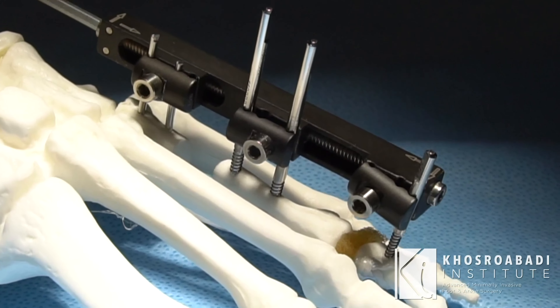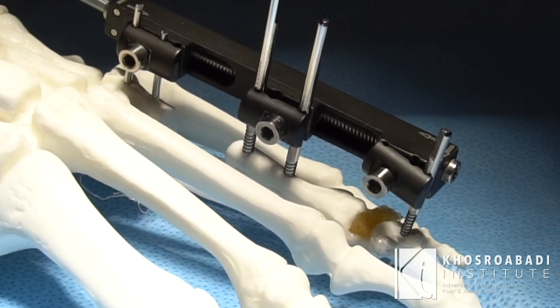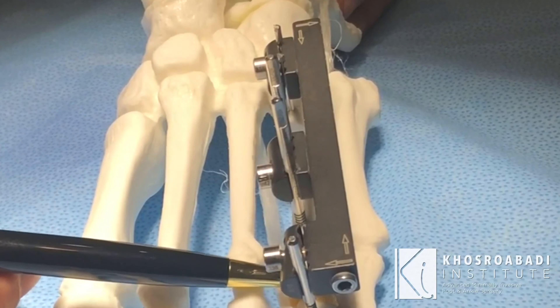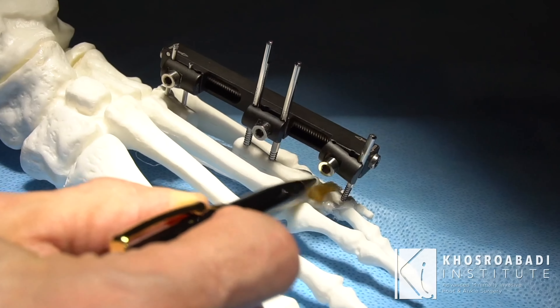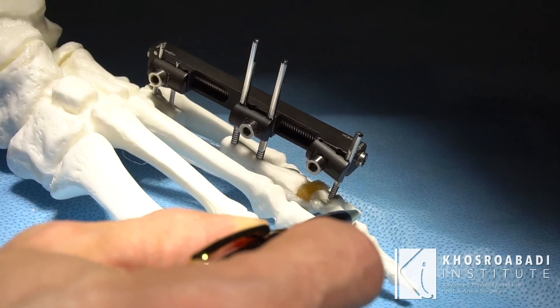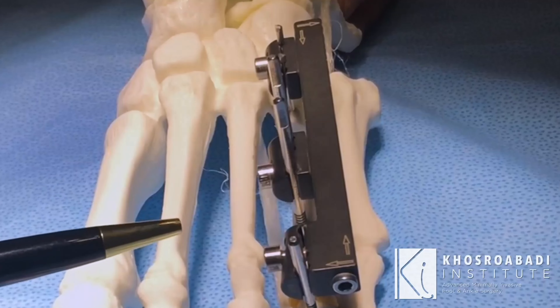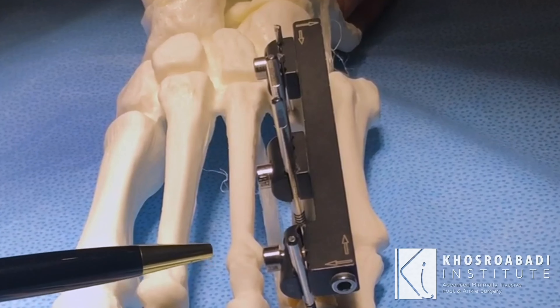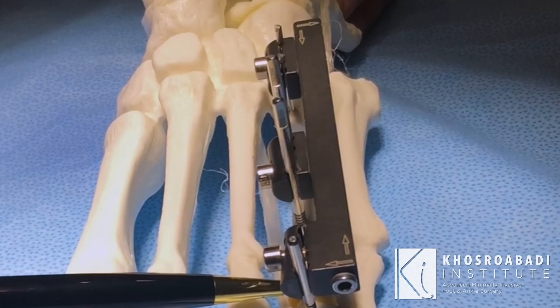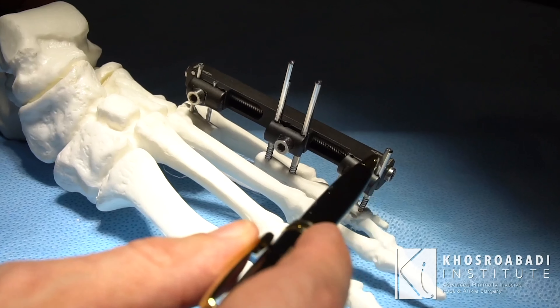As I'm lengthening the bone, you can see the metatarsal starts moving with the segment of the bone. We can even measure this — the distance between that bone and this bone stayed the same because the segment of the bone was taking the toe with it and maintaining the joint space. This construct helps prevent one of the most common complications of metatarsal lengthening: subluxation of the joint and the toe rising up.